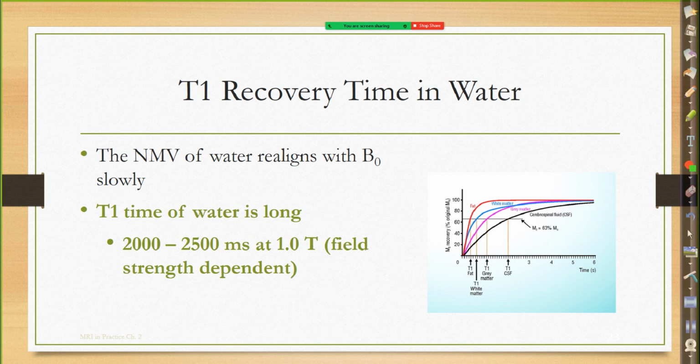It's not non-existent, because these two things are happening at the same time, but they're two separate processes. So it's good that you associate T1 with the surrounding environment. And that could be other elements, not just the neighboring hydrogen nuclei, okay? It's giving off energy to the surrounding environment. But T2, and we'll talk about it here in a second, is strictly spin-spin. And that's the neighboring hydrogen nuclei. So they are happening at the same time, but they are two separate processes.